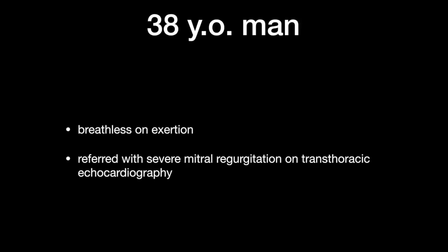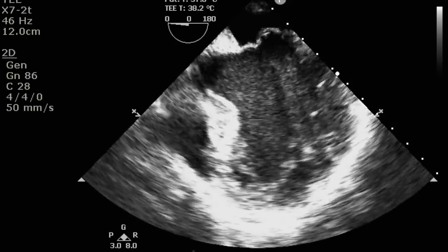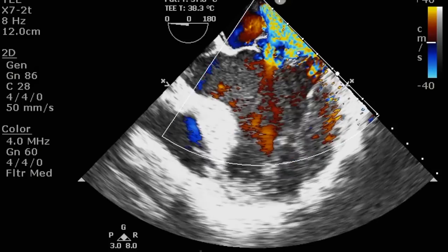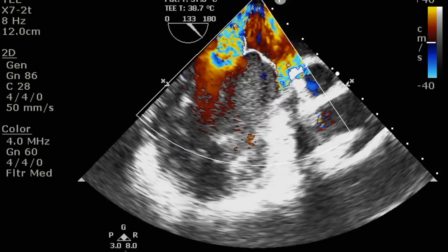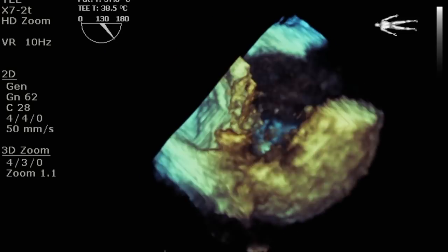Our patient is a 38-year-old man, breathless on exertion, who was referred with severe mitral regurgitation on transthoracic echocardiography. Transthoracic echocardiography revealed bi-leaflet prolapse with significant mitral regurgitation, mainly due to the A2-A3 segment and prolapsed posteromedial commissure and P3 segment of the posterior leaflet.